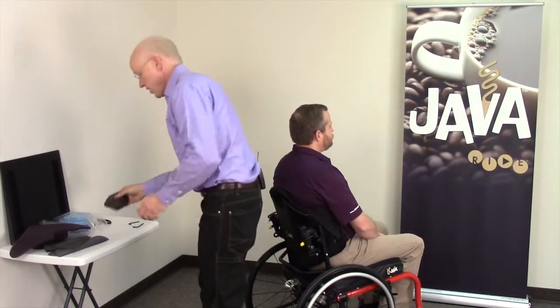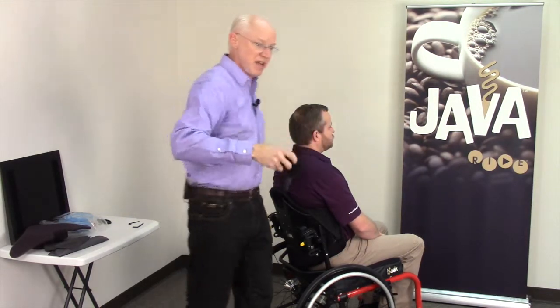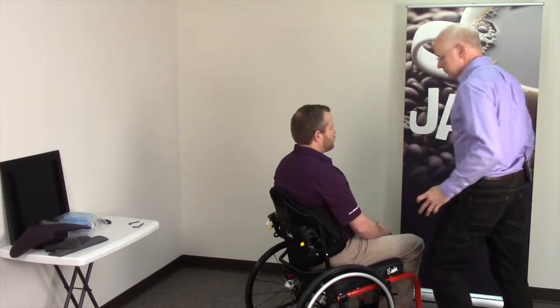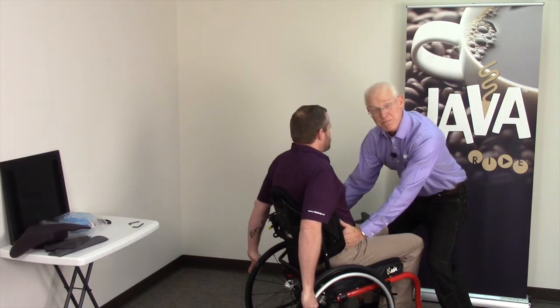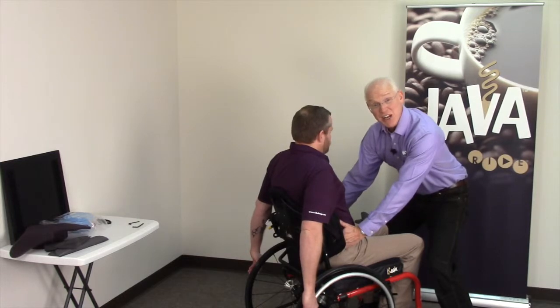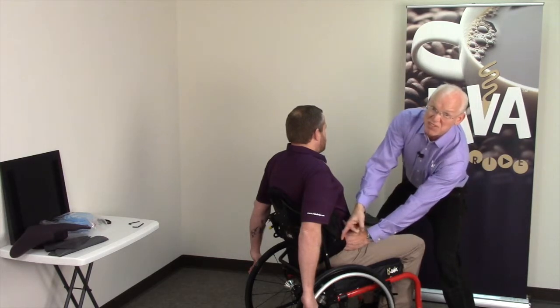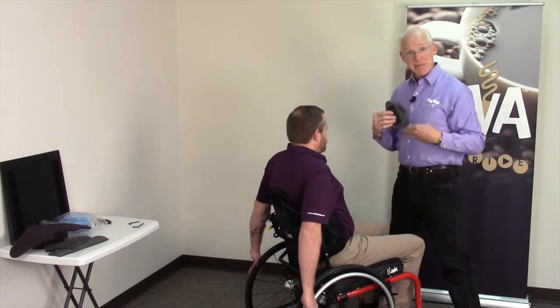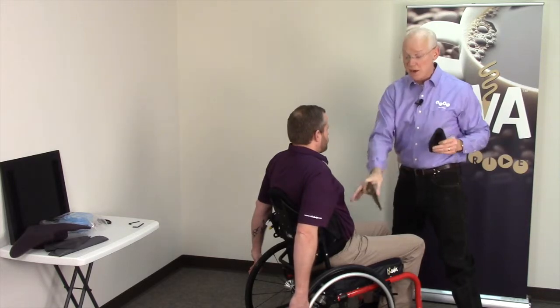Because your Java back comes with these nice pelvic wedge accessories. These can be fit right in the posterior lateral pelvis. So I can reach in, posterior lateral at the pelvis on Ryan. And if I feel some space in there, I'm not getting good contact there, I can establish, relative to possibly even the seam for the flap, what height these wedges need to be. I can have them come out of the back support, and these will mount onto a platform with some Velcro behind the comfort foam on the back.